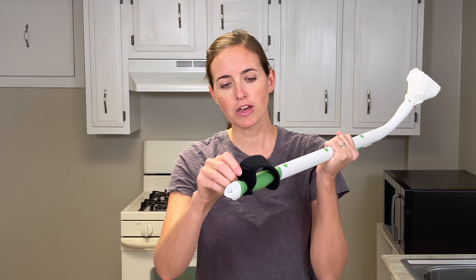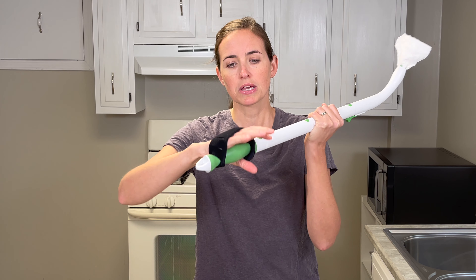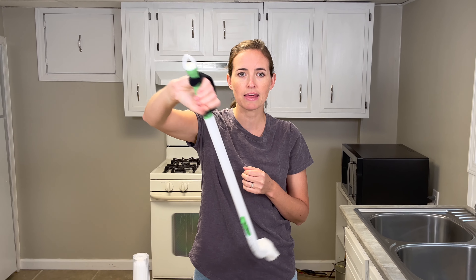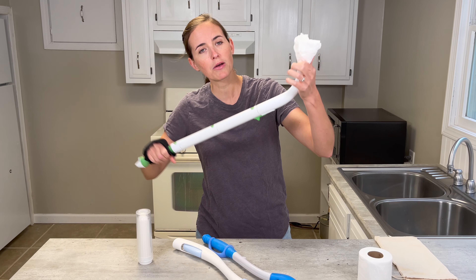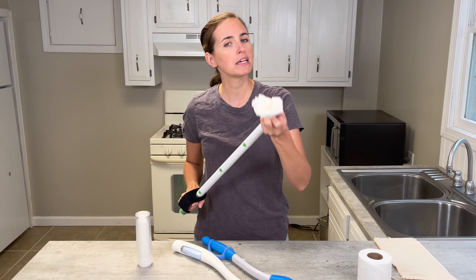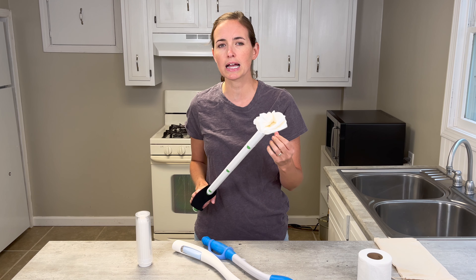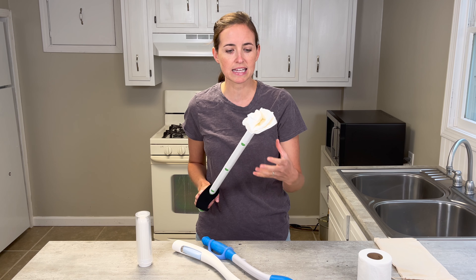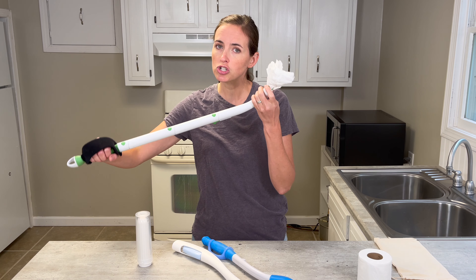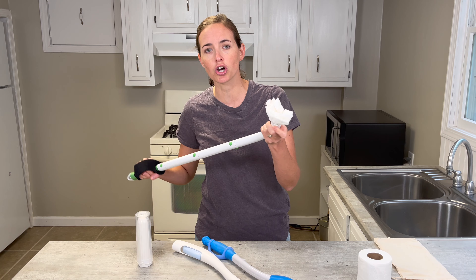I've also added a handle to this one, so depending on whether you have low dexterity, this covers you there too — I can put my hand in for added support and reach back from the front to apply it for wiping. One consideration: it is a hard plastic end. The population I have some pause about is individuals with low sensation on their bottoms — such as those with spinal cord injuries or neurological conditions — as they're at risk for wiping too aggressively and causing skin tears.